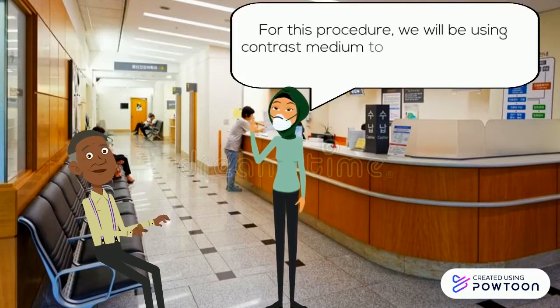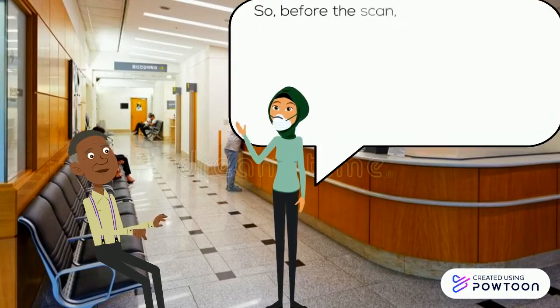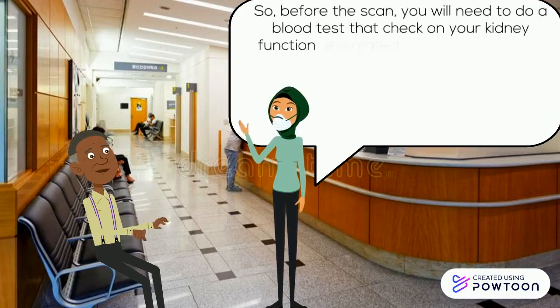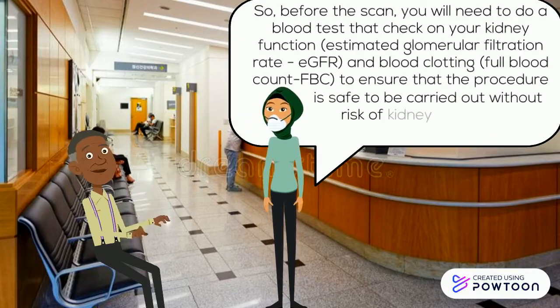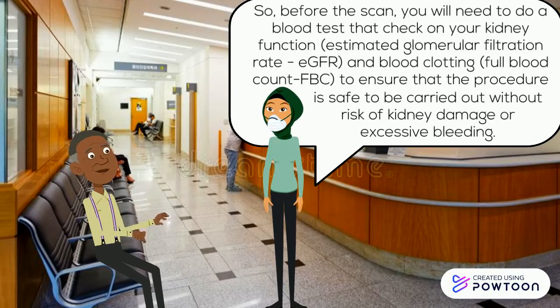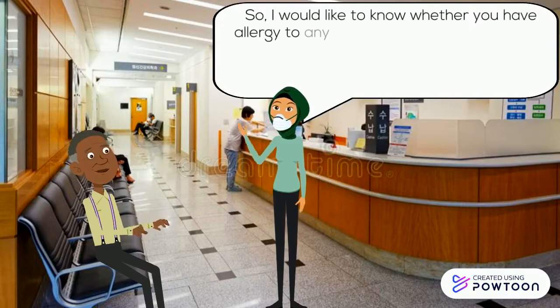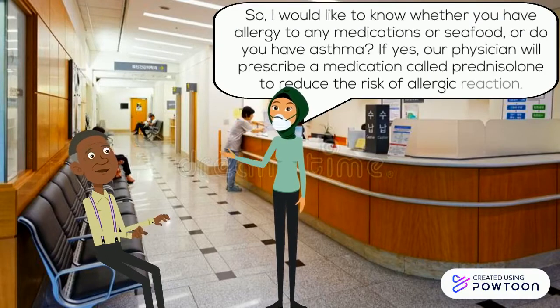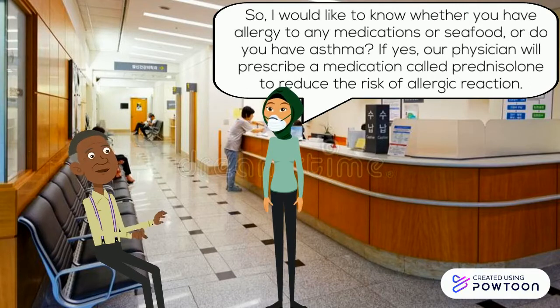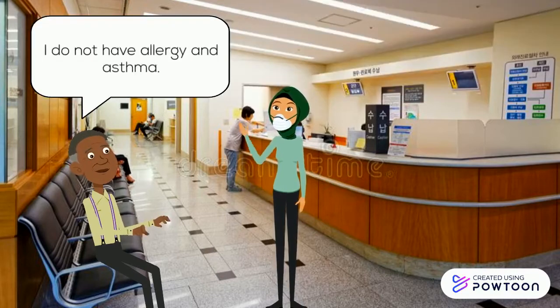For this procedure, we will be using contrast medium to get a better look at the structure. So, before the scan, you will need to do a blood test that checks on your kidney function and blood clotting to ensure that the procedure is safe to be carried out without risk of kidney damage or excessive bleeding. Noted. So, I would like to know whether you have allergy to any medications or seafood, or do you have asthma? If yes, our physician will prescribe a medicine called prednisolone to reduce the risk of allergic reaction. I do not have allergy or asthma.